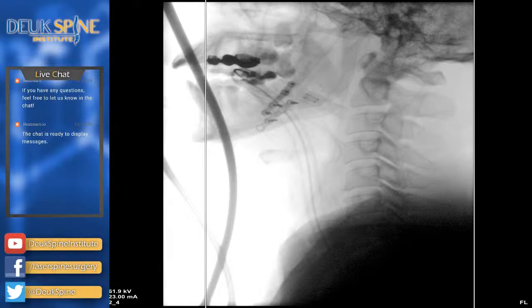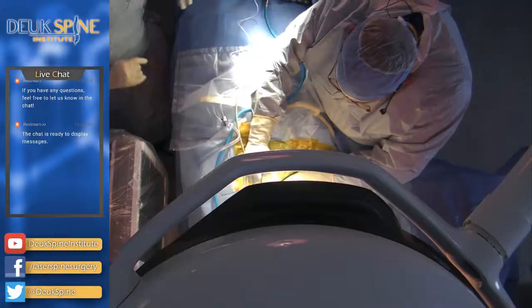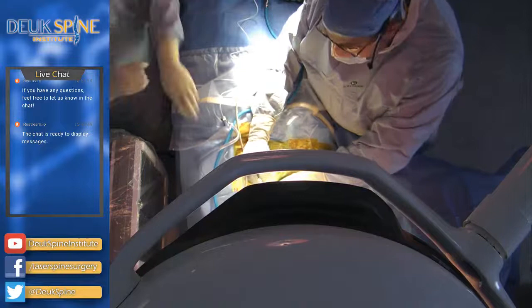So without further ado, we're going to get started. Just to orient you, the chin is here, the face is looking up, and this is the front of the neck, Adam's apple. And I'm going to be going just to the side of the Adam's apple, palpating the spine with my fingers as I am doing such. I'm touching the middle of the spine, actually, and because he's relaxed, I'm able to do so.